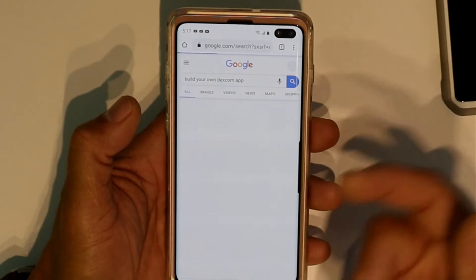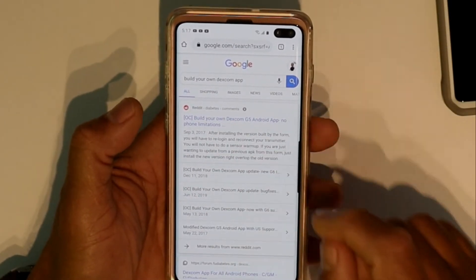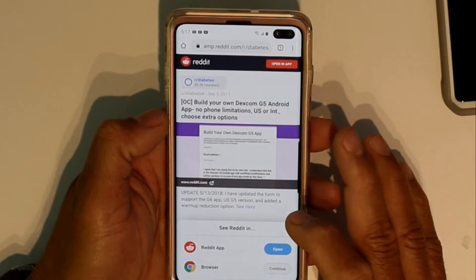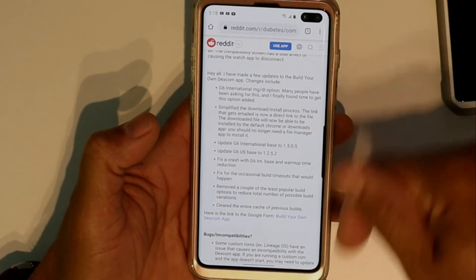When you search for it, it's going to bring it up. You're going to search for "Build Your Own App" — it's from Reddit. We really have to thank that guy for doing that app. I'm going to make sure I leave that link for you guys down below.